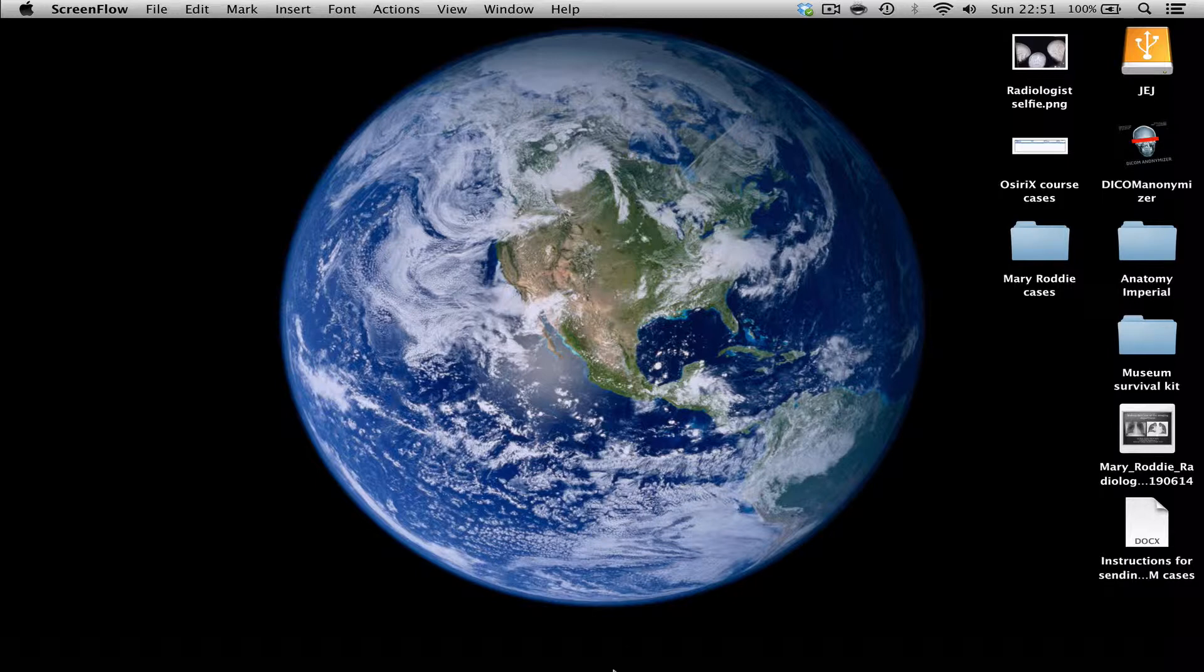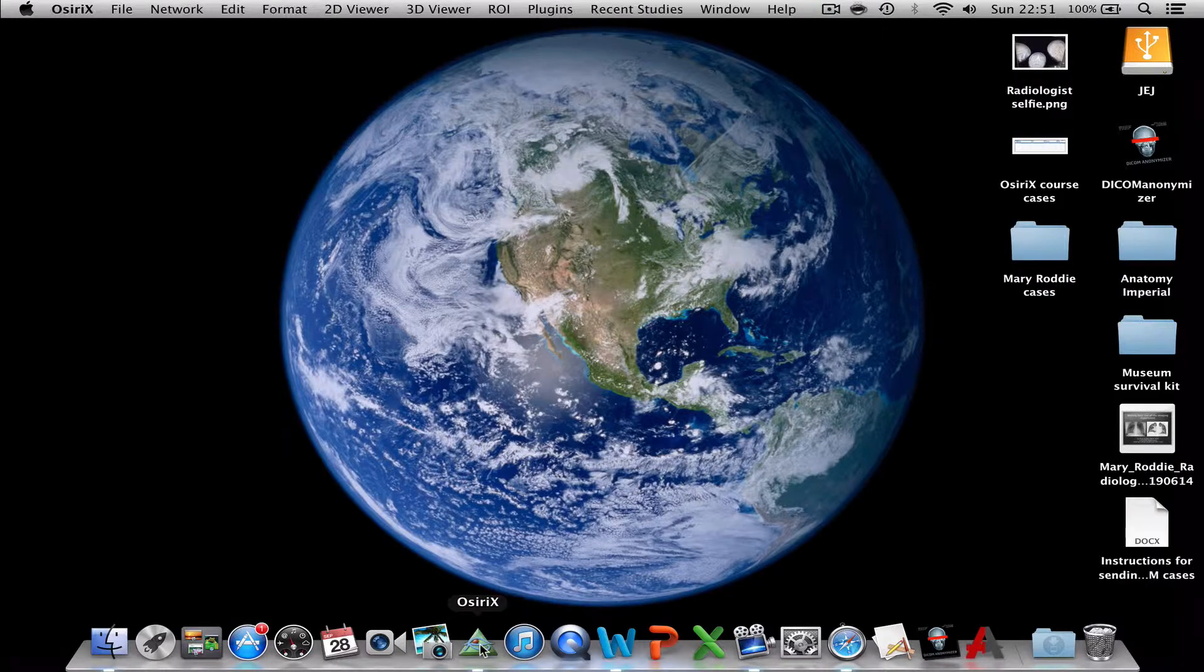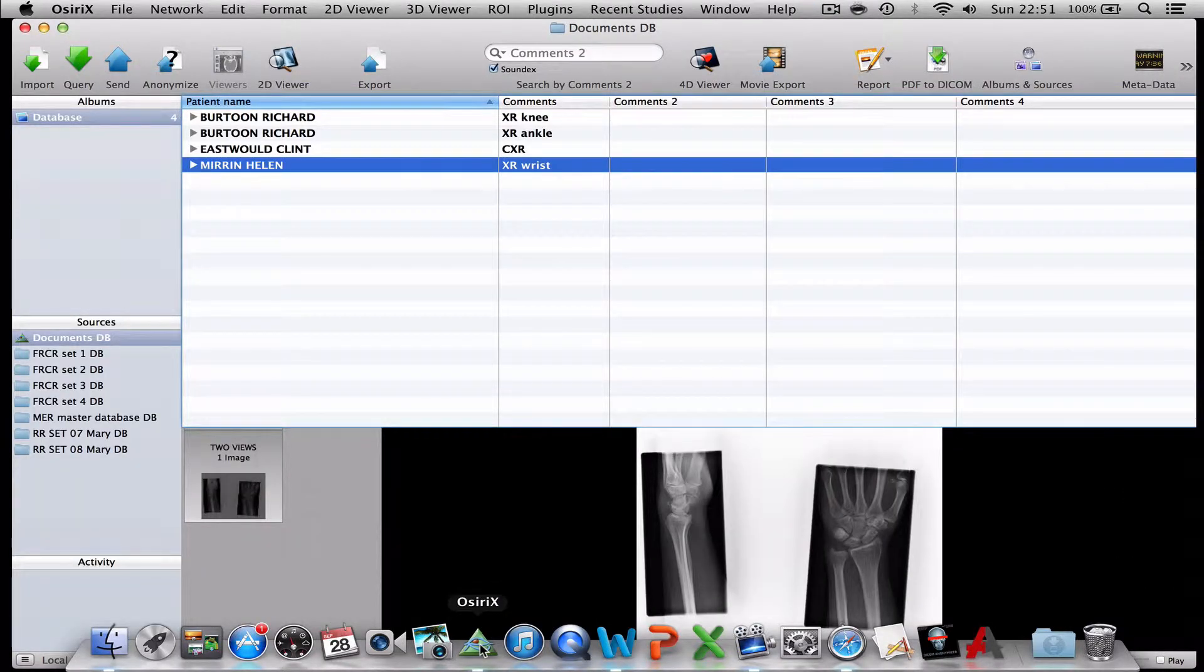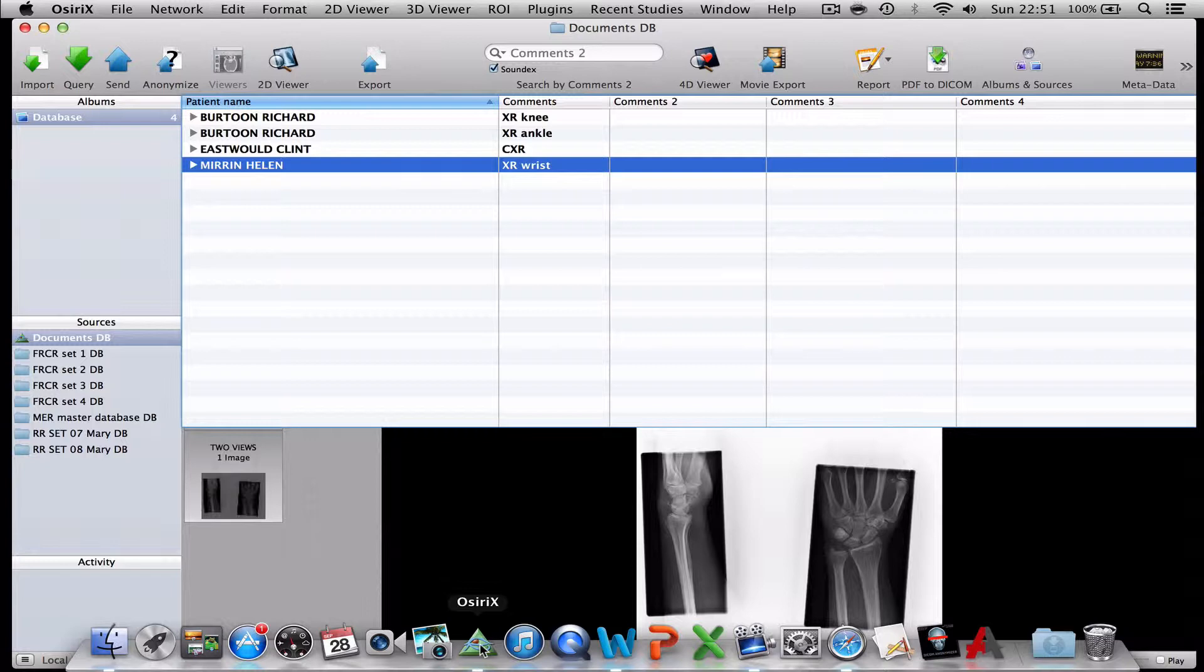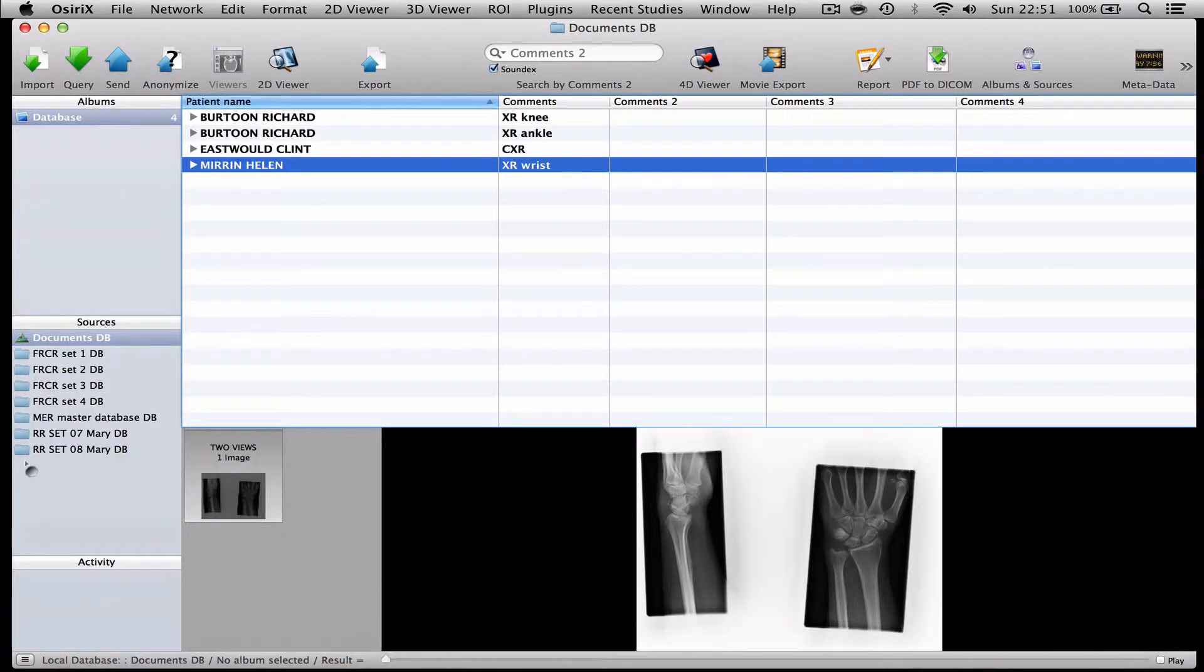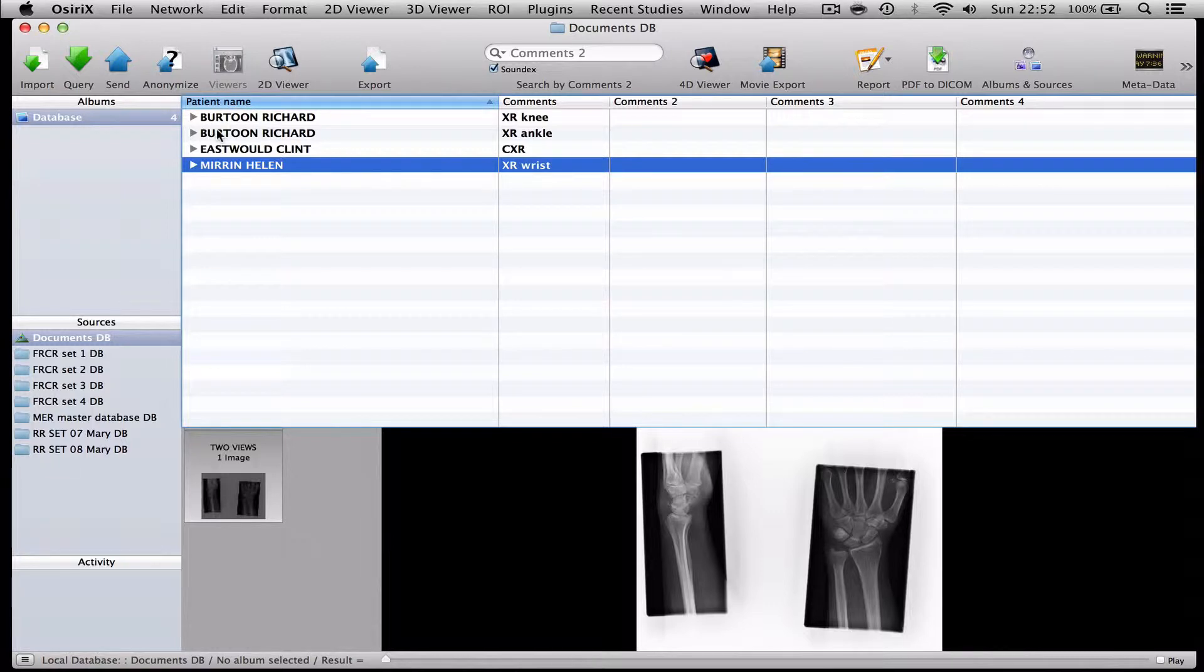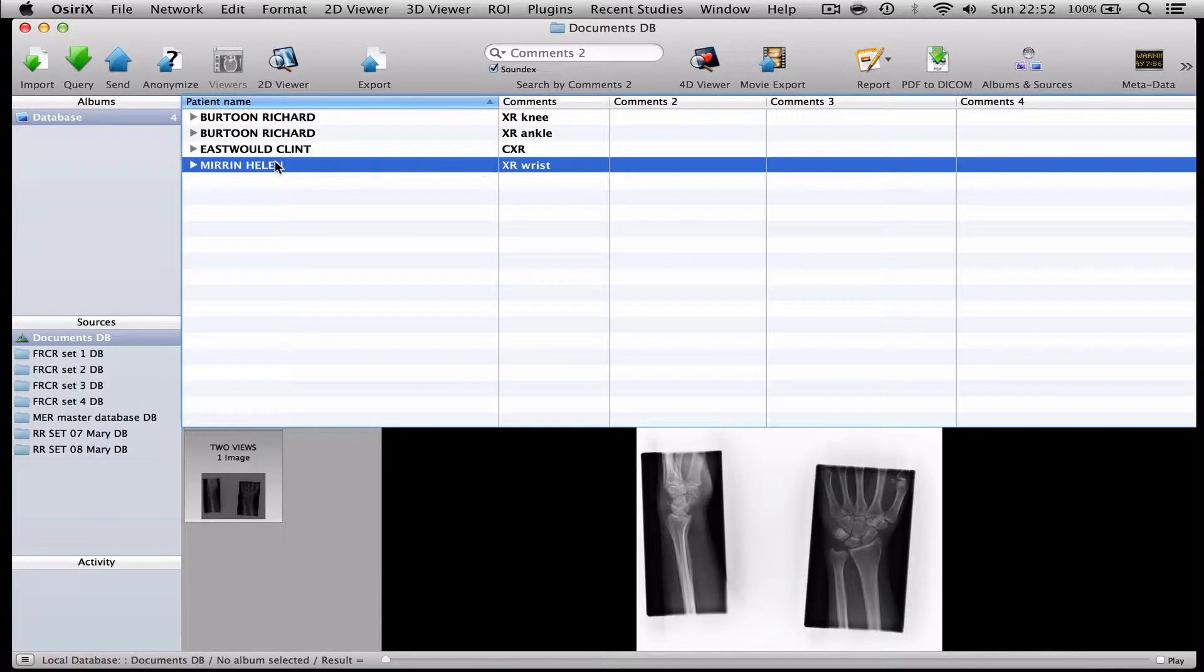So if I open up my OsiriX and at the time of recording this video I'm using version 5.9 with the 64-bit extension, you will see that in my documents database I have imported three patients. There are two examinations on Richard Bertoon and single examinations on Clint Eastwood and Helen Mirren, and you may have guessed that these are fictitious names for the purpose of this demonstration. So I could simply send those cases off to my colleague but they're not anonymised so I would prefer to anonymise them first.